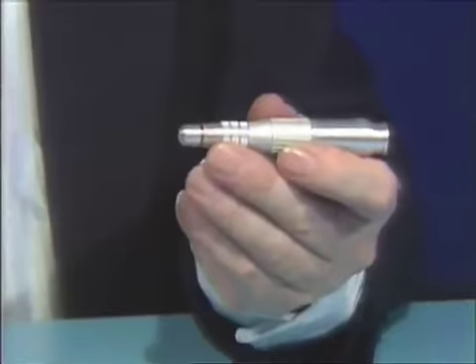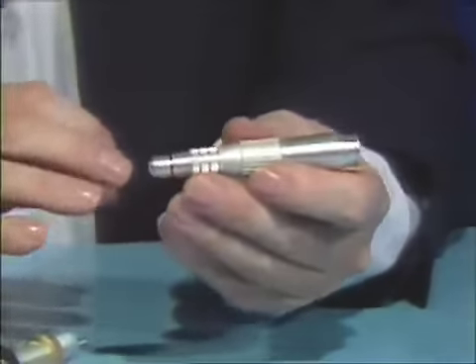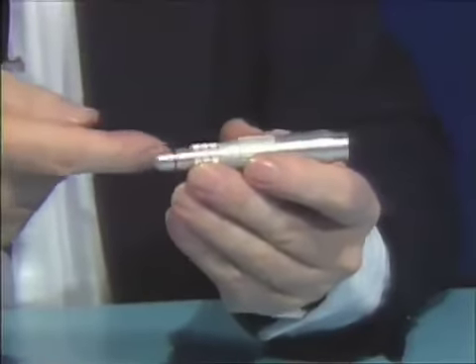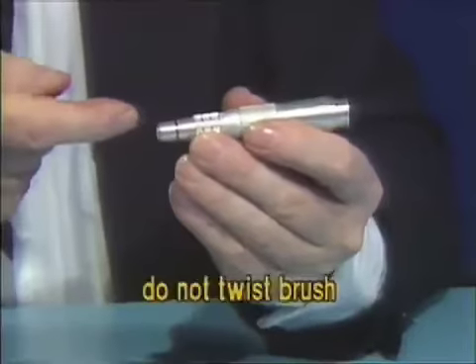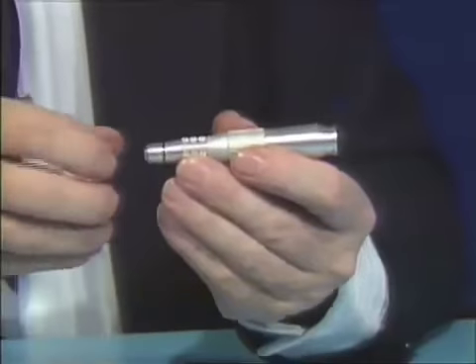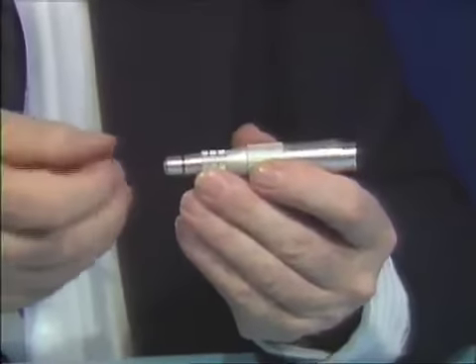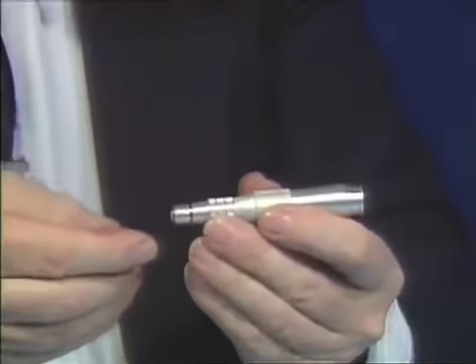In the box you received, there should be two nylon brushes. Take one brush and insert it inside the front portion, going back and forth in and out. Do not twist the brush — the nylon bristles will break off and embed themselves into the slots of the chuck, and as a result you will not be able to tighten the burr, mandrill, or shipping pin.